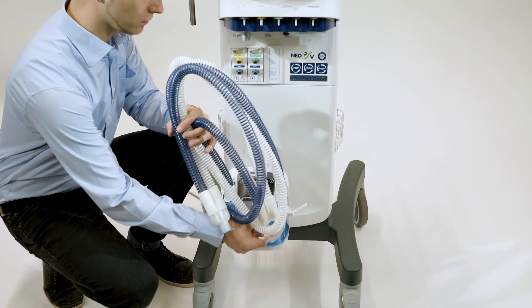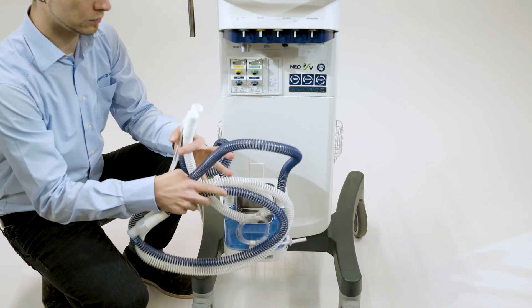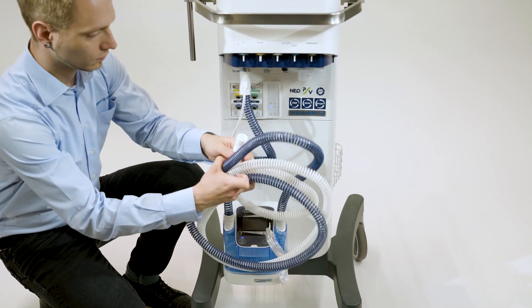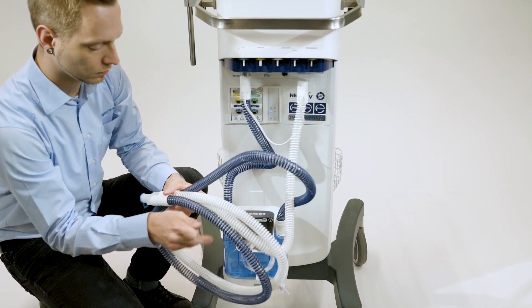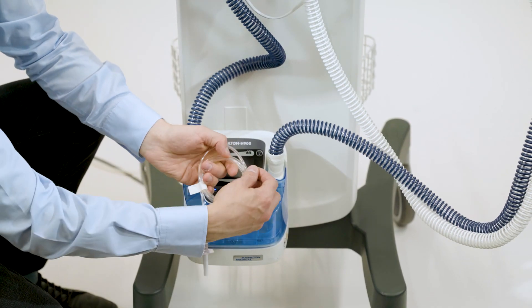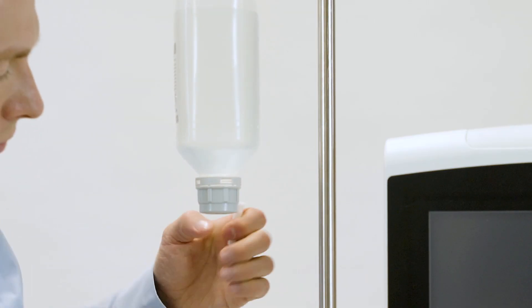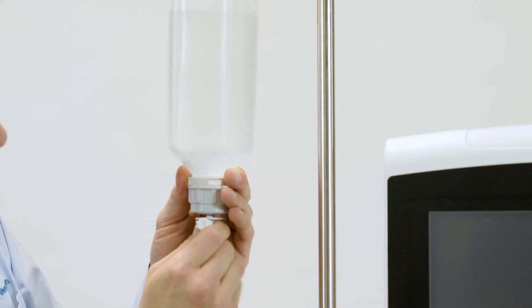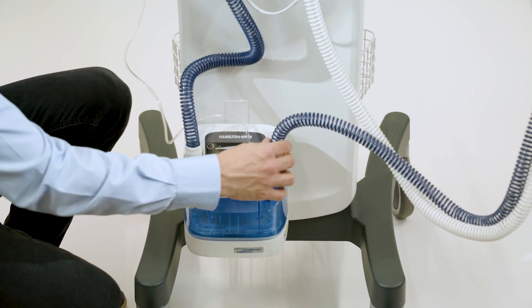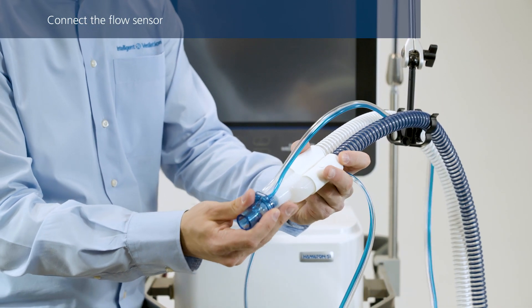First, insert the humidifier chamber. Connect the shorter blue tube to the inspiratory port on the ventilator, and then connect the expiratory tube to the expiratory valve. Insert the water feed line into the water bag or bottle. Make sure that all electrical contacts on the breathing circuit match the connecting element on the humidifier. Insert a flow sensor into the breathing circuit in front of the patient connection, that is, the Y-piece.